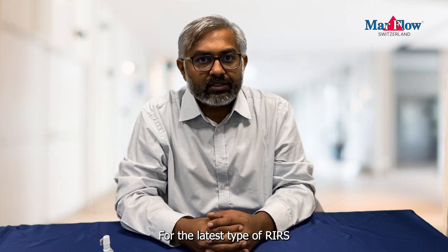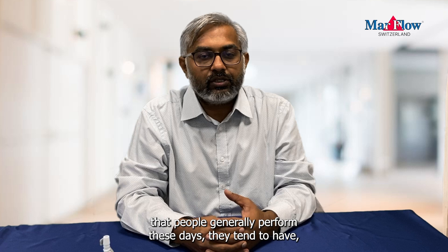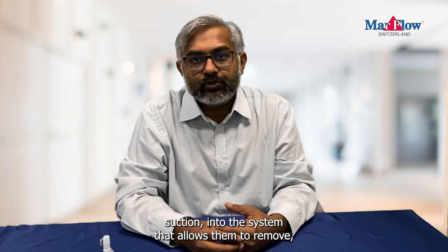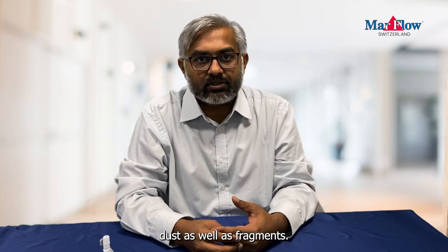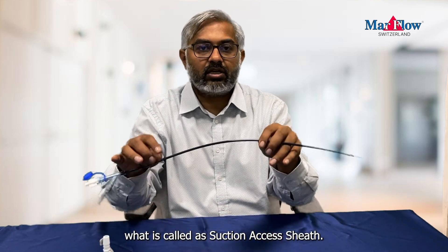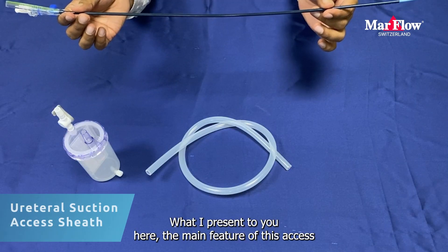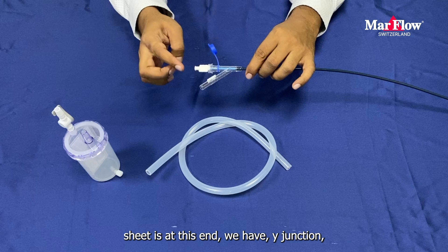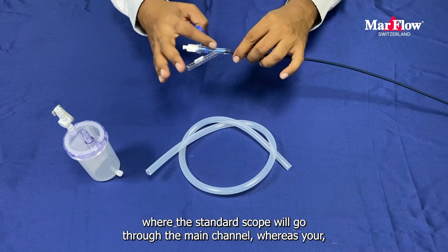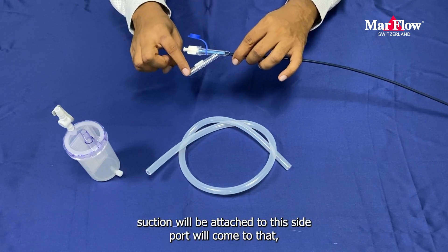For the latest type of RIRS that people generally perform these days, they tend to have suction into the system that allows them to remove dust as well as fragments, and that happens through an access sheath — what is called a suction access sheath, which I present to you here. The main feature of this access sheath is at this end, where we have a Y-junction where the standard scope will go through the main channel, whereas your suction will be attached to this side port.